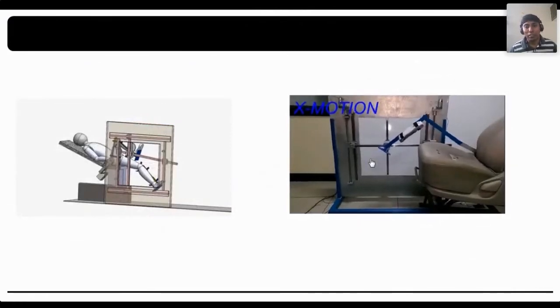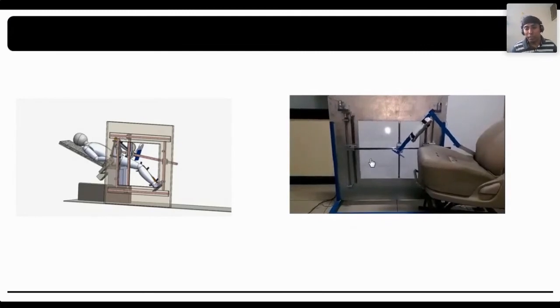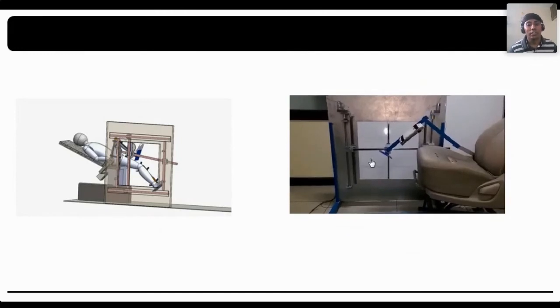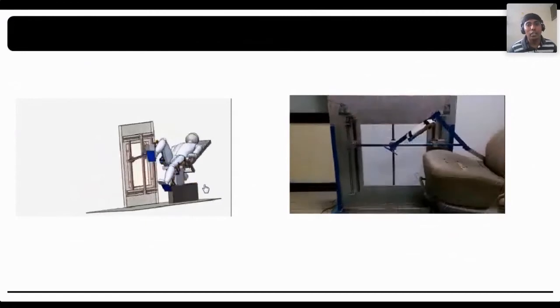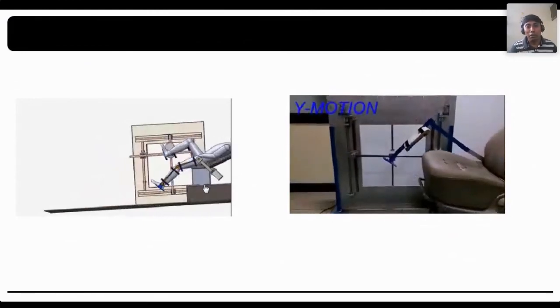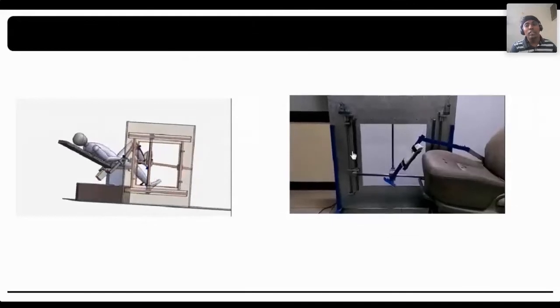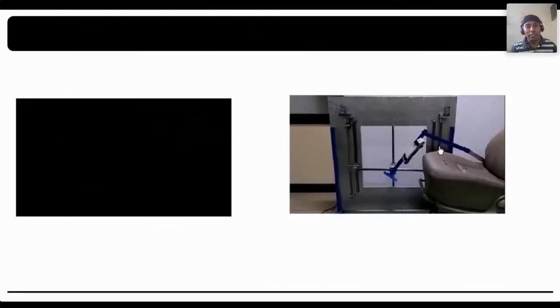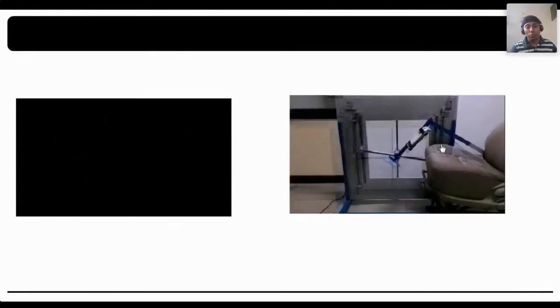Unfortunately, that video was not with me on this laptop. I just show the motion which is generated by the system. And this is the system which was proposed conceptually, and later modified. Since it works with a ball screw joint, it doesn't really require a static balance system because these are statically balanced. So that's why we did not show that in the picture.